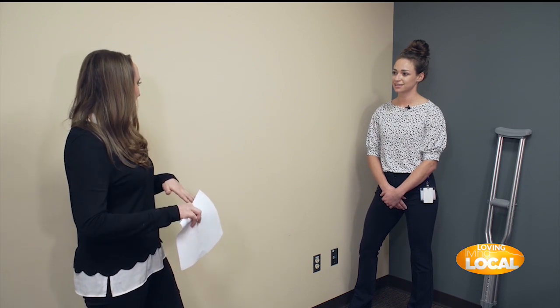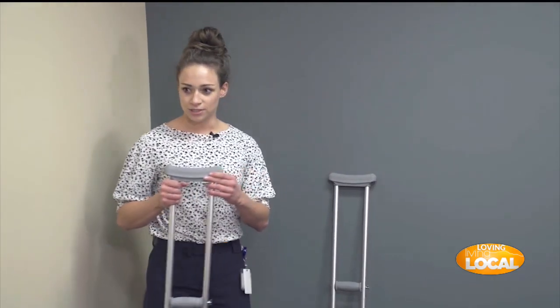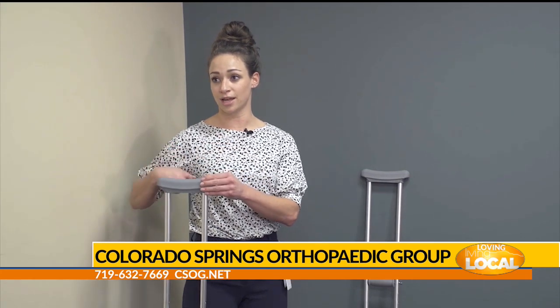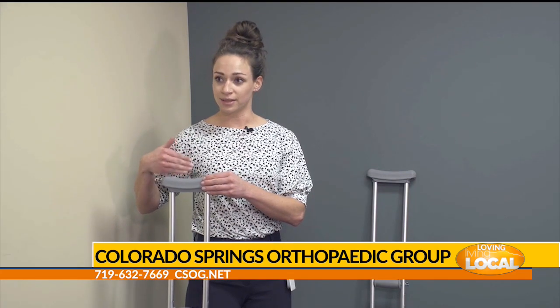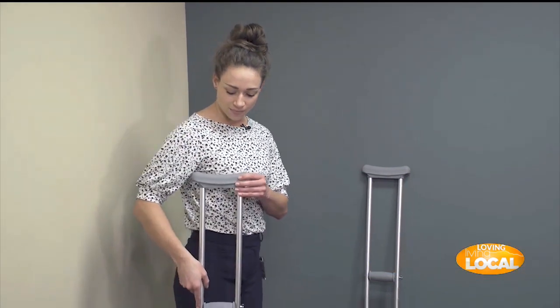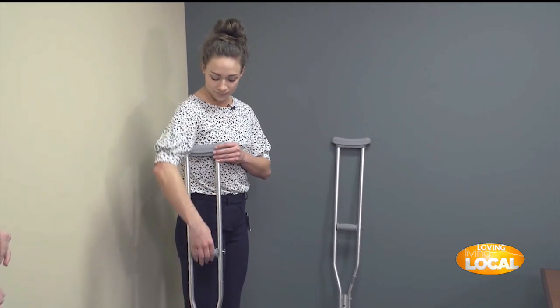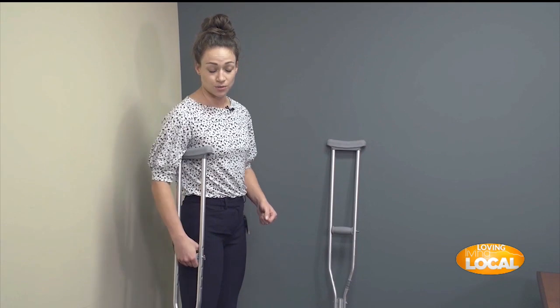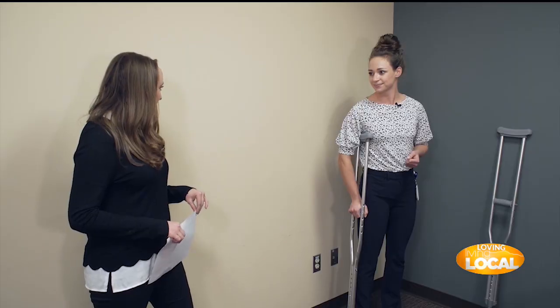To make sure crutches are the right height, the top of the crutch should sit two to three finger-widths below the armpit. You don't want it right underneath the armpit because you'll compress lymph nodes, arteries, and muscles. You also want to make sure the crutch allows a slight bend in the elbow, so that if you stumble you won't hyperextend your arm.